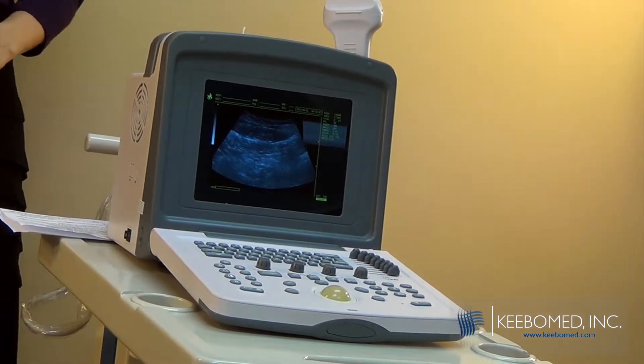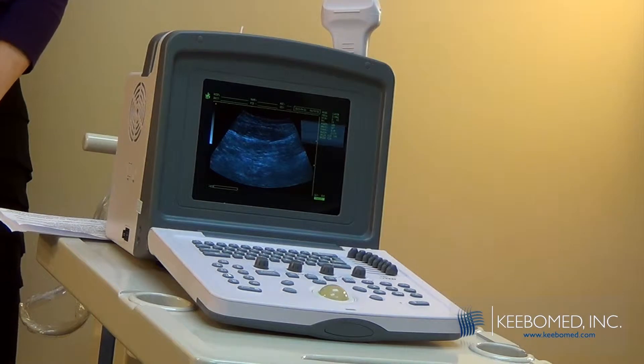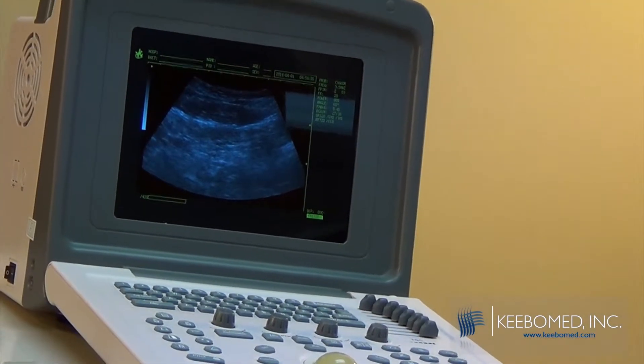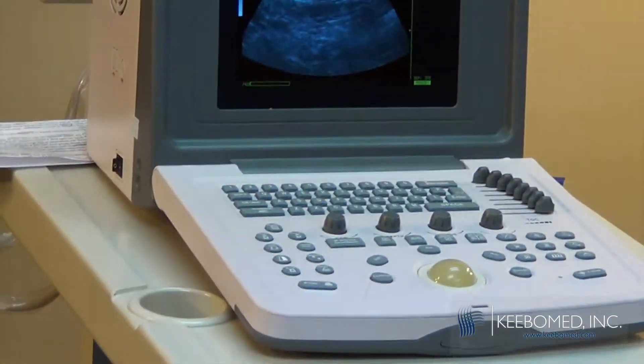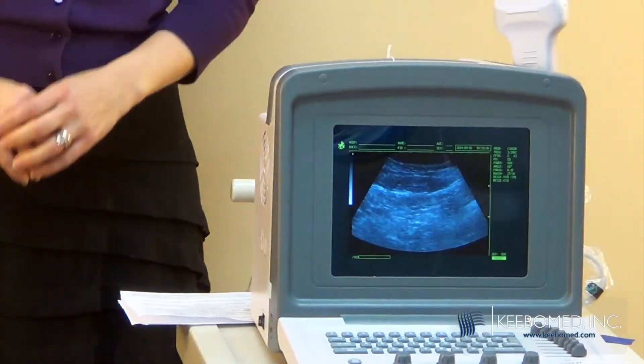Another thing that we've redesigned is the USB port. Previously you were not able to save images on a flash disk and then transport it to the PC. Now you're able to do that — you can save images to a flash disk and transfer them to a PC. That's a great feature.